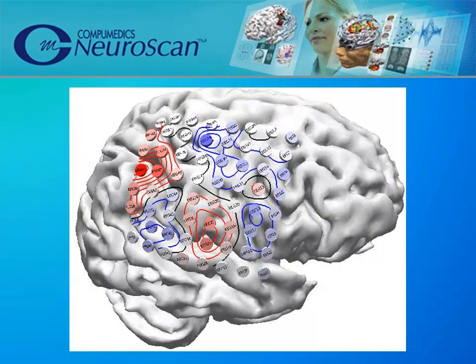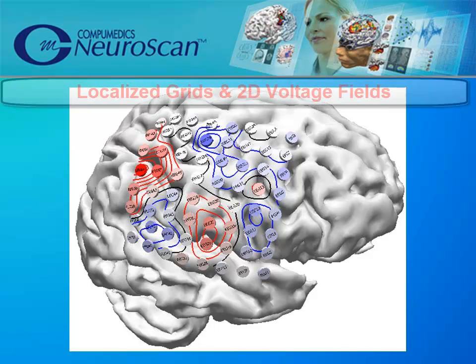In this example, the cortical grid electrodes extracted from the CT are measured and placed on the segmented cortex from the MRI. The colors show positive and negative voltages from the EEG recordings.